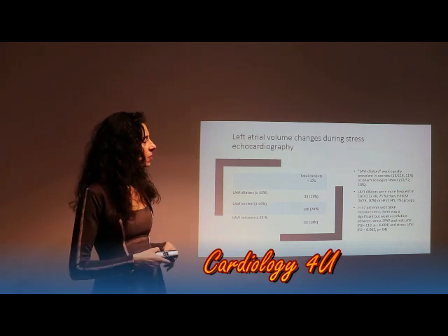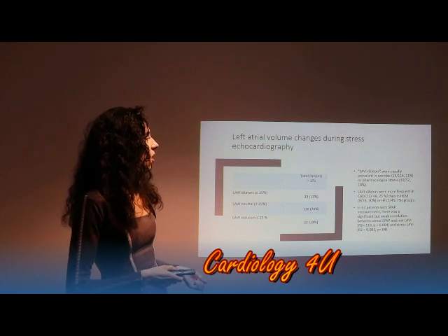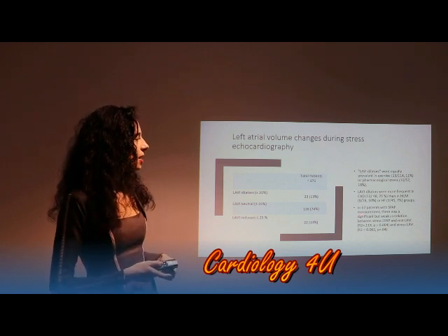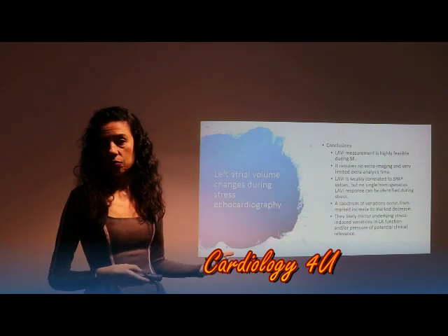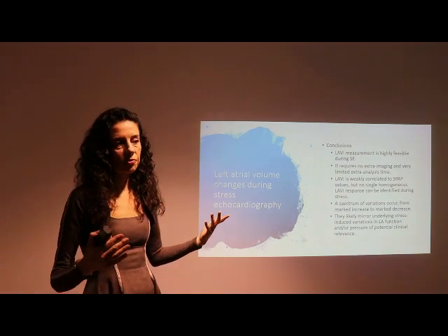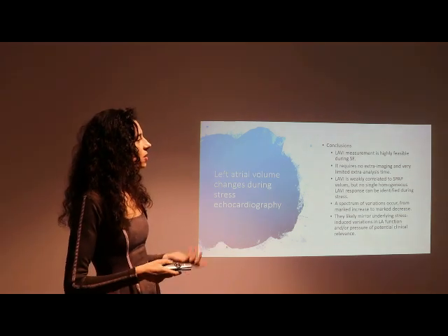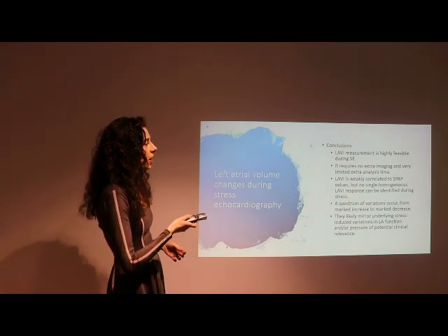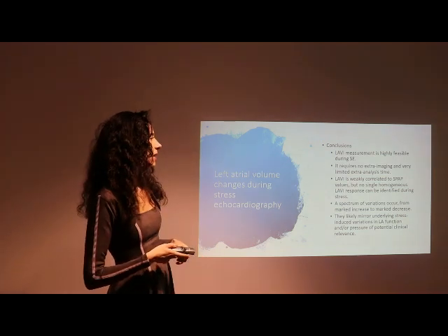Also, when we measured systolic pulmonary artery pressure, we found a correlation between SPAP and rest and stress LAVI. So our conclusions for now from this very new, first and innovative LAVI stress echo study were that LAVI measurement is highly feasible during stress echo, that it requires no extra imaging and very limited extra analysis time.